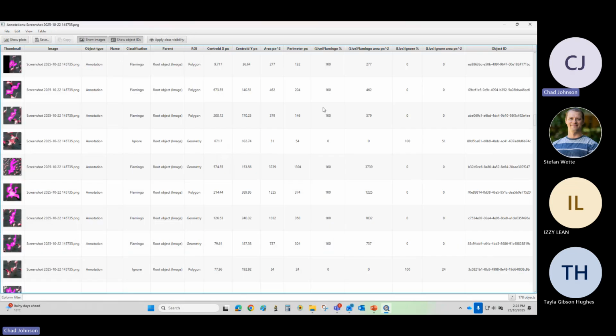For shape factors and things like that, you typically can only get area, perimeter. If you're doing the object detection with the fluorophores, the multiplexing image, there's some intensity measurements, but that's pretty much it. Fiji has many more statistics. Circularity is one that I really wish that they would put in there, although I think you can calculate circularity from the perimeter and the area anyway.